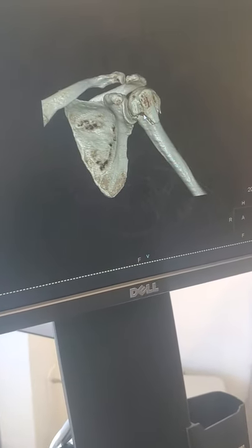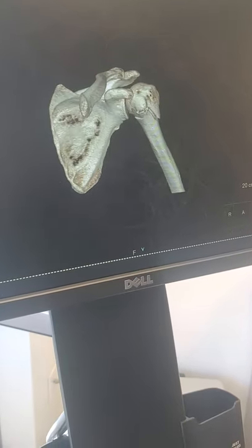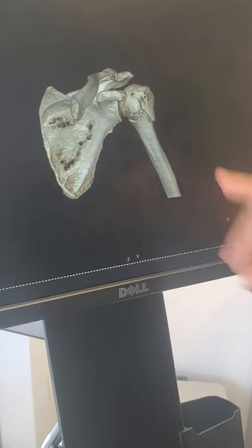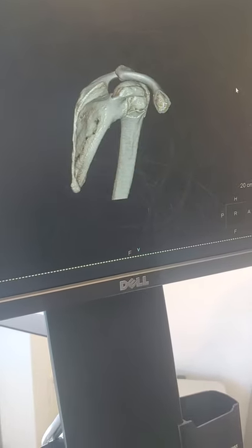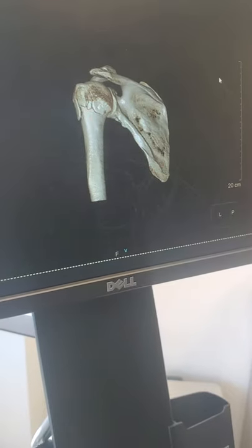So this has the ball here, the socket there, this is your scapula bone, and as we rotate around we can see that fracture through there. This is looking from the back, so the break is through there, the shaft is right there.